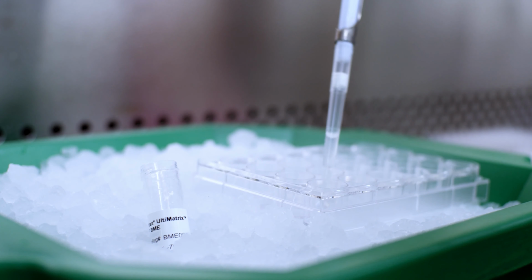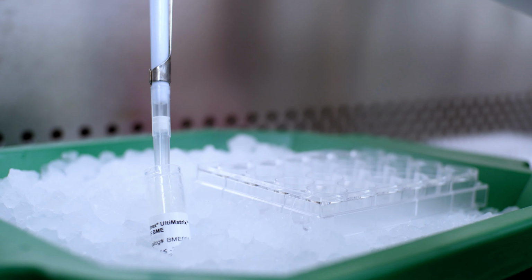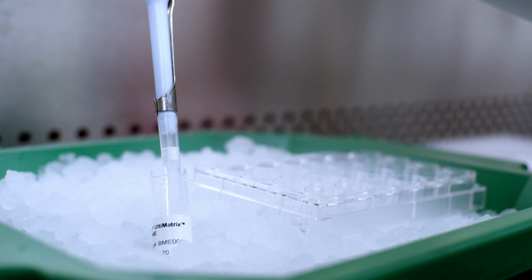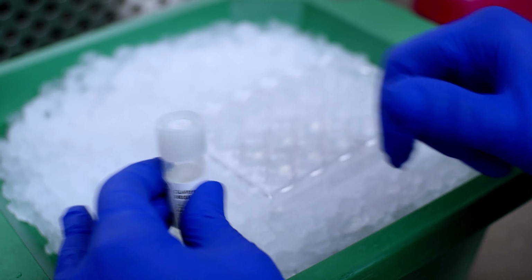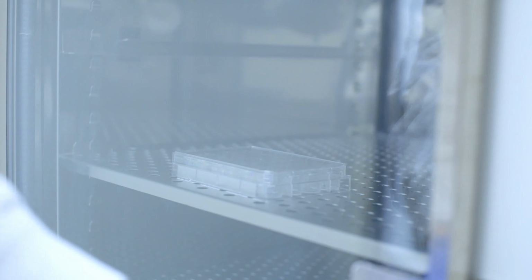To create a thick layer for growing cells on, either dispense Cultrex BME directly into the culture vessel, or if you're embedding cells in the matrix, mix cell suspension with Cultrex BME prior to adding into the culture vessel. Add enough volume to cover the growth surface. Incubate the plate at 37 degrees Celsius for 30 minutes to solidify the matrix.